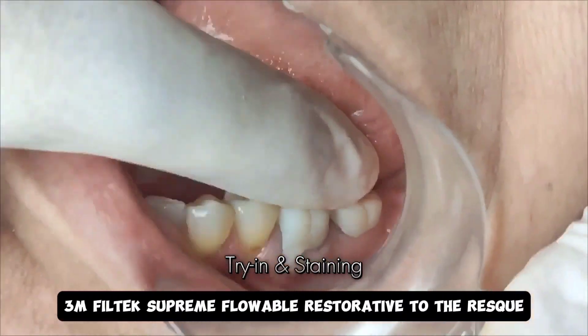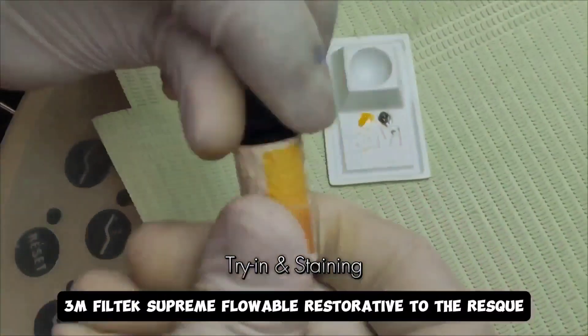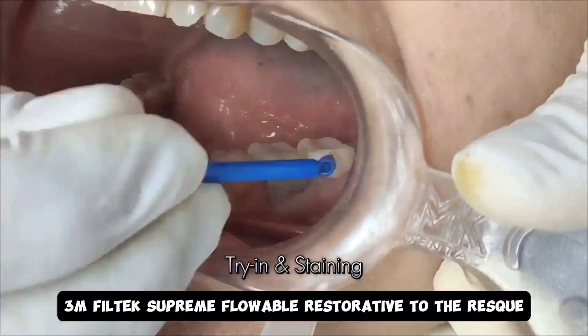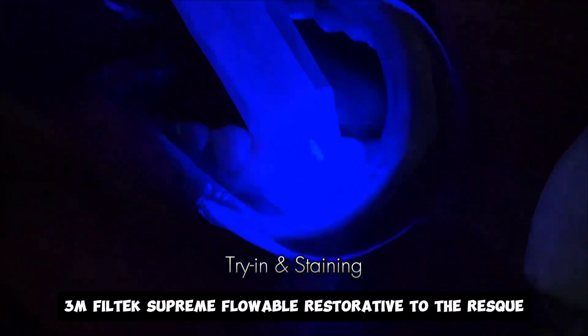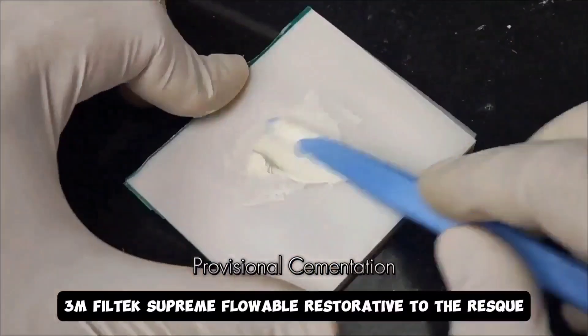This allows for beautiful margin definition, and once I have the margin correct, I'm just going to improvise a little. This is me using different stains or different tints from Coltène, and I am going and applying these onto those provisionals — it's just an attempt to make those provisionals look a tad bit more aesthetic.